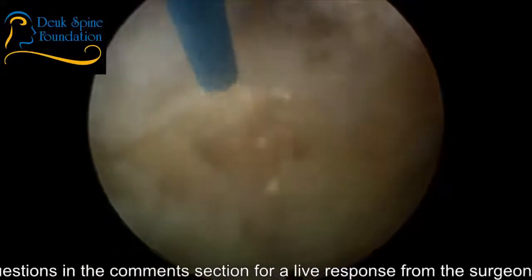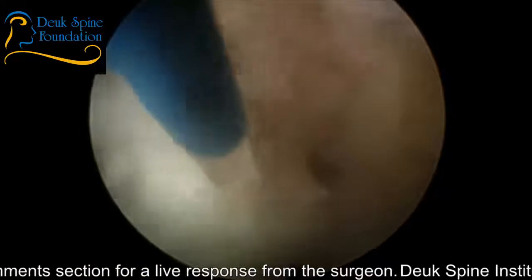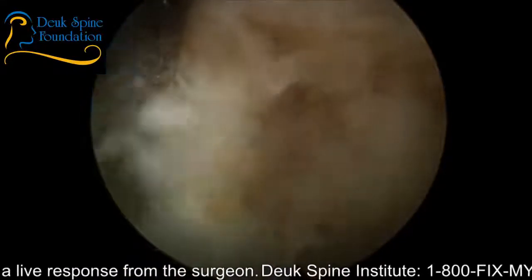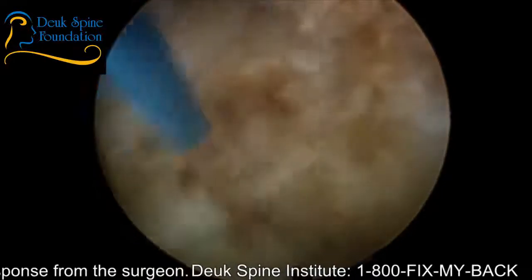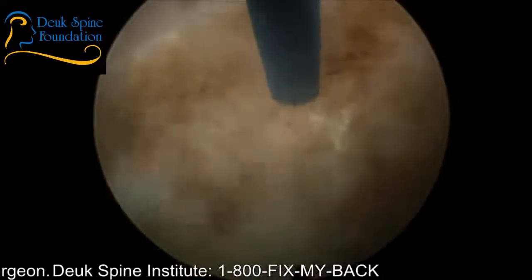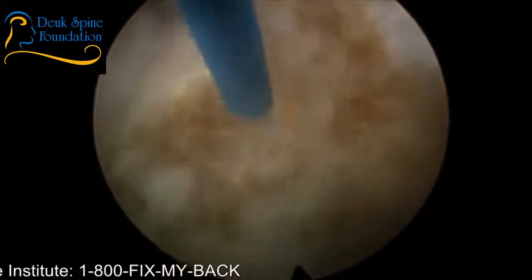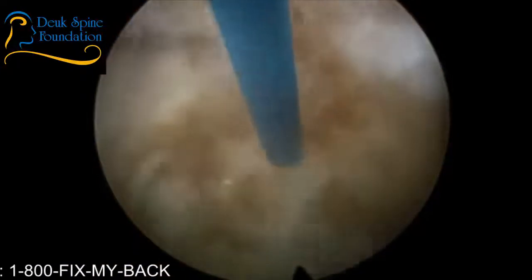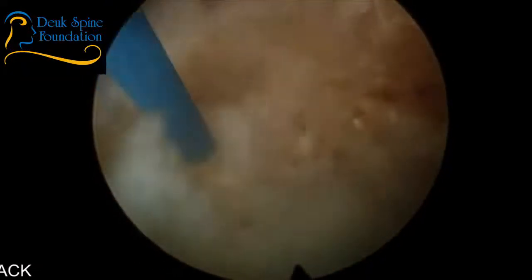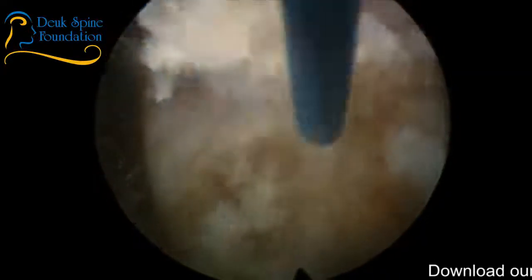So again, normally we're used to seeing it blue because we inject the dye. Today we didn't inject dye because I couldn't get the needle into the disc space to inject the dye. So I have to do this without the dye, but this is all part of the disc herniation that I'm zapping away. To me it looks like it's been here for a while. This is not a fresh young disc herniation. That's a bone spur right there that I'm working on. It's gone now. I've done just about all I can do.